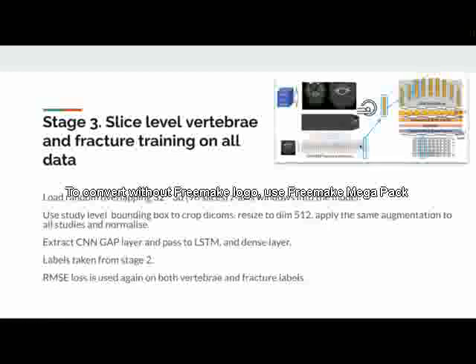This runs very long. It runs about 10 hours on a 40 gig GPU card. Because there's a lot of data to work through, we're taking a lot of different overlapping slices of those 96 slices. So we've got a pretty strong model at this stage, which is able to pick up which vertebrae it sees, and the chance that it's fractured or not.